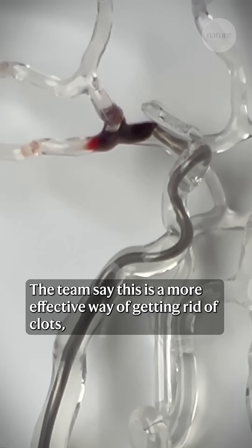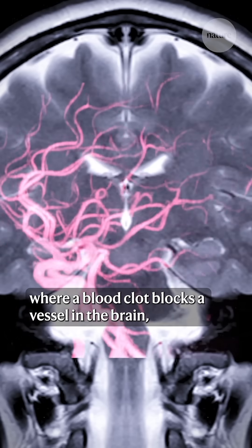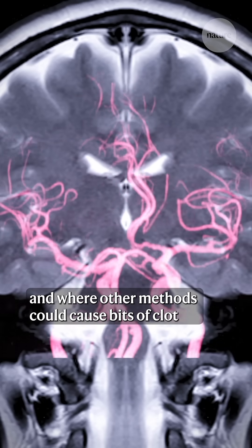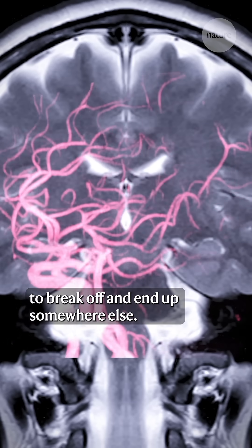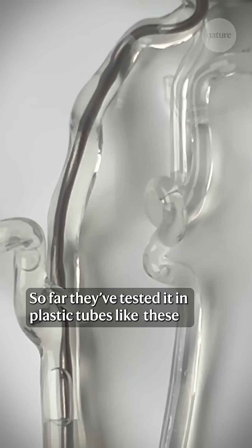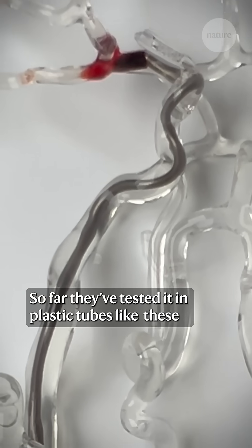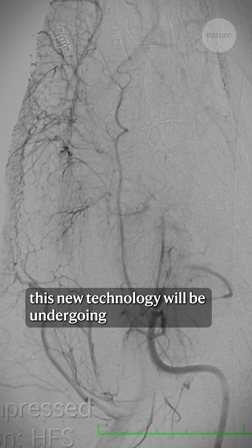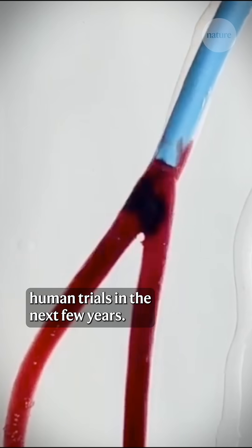The team say this is a more effective way of getting rid of clots, particularly in cases like stroke where a blood clot blocks a vessel in the brain and where other methods could cause bits of clot to break off and end up somewhere else. So far they've tested it in plastic tubes like these and in pig organs, but the hope is that this new technology will be undergoing human trials in the next few years.